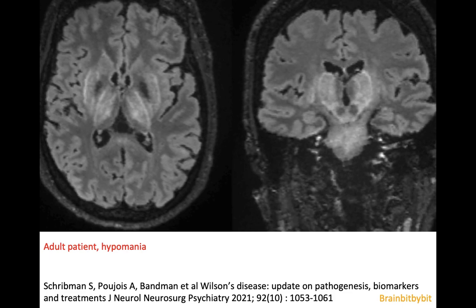The neuropsychiatric symptoms usually present in the third and fourth decades. They are caused because the basal ganglia are involved in movement and mood regulation, and this adult patient presented with hypomania. On the FLAIR image you can see mainly involvement of the outer rim of the putamen, a sign classic for Wilson's disease, and again you can see the sparing of the red nucleus.